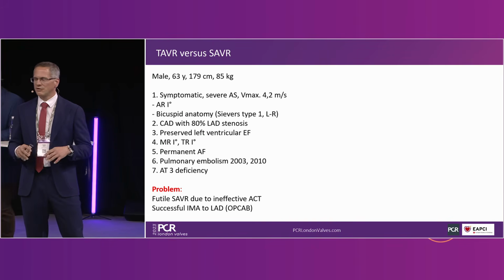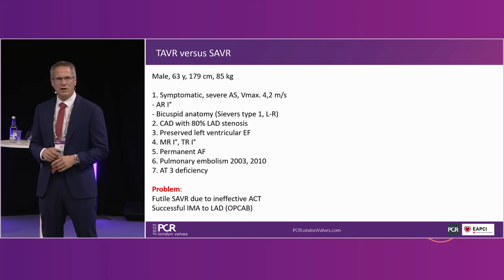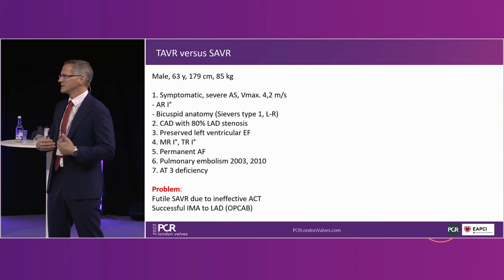They weren't able to get any significant anticoagulative state during the surgical procedure and therefore only performed off-pump cardiac surgery, a bypass graft to the LAD. The patient woke up eventually, had a good coronary result, but was given back to the heart team.